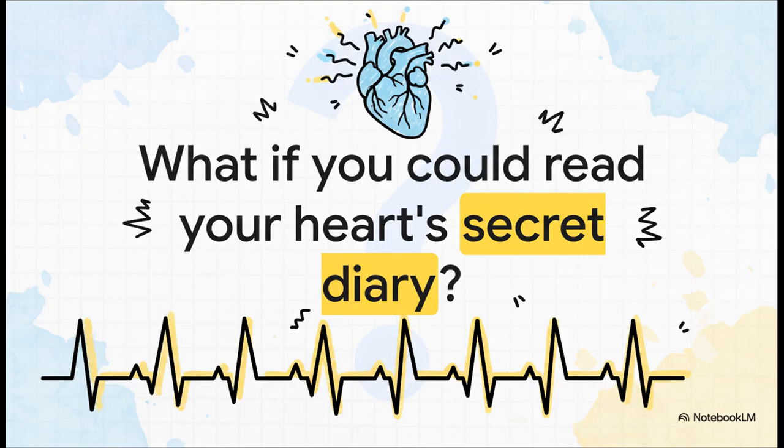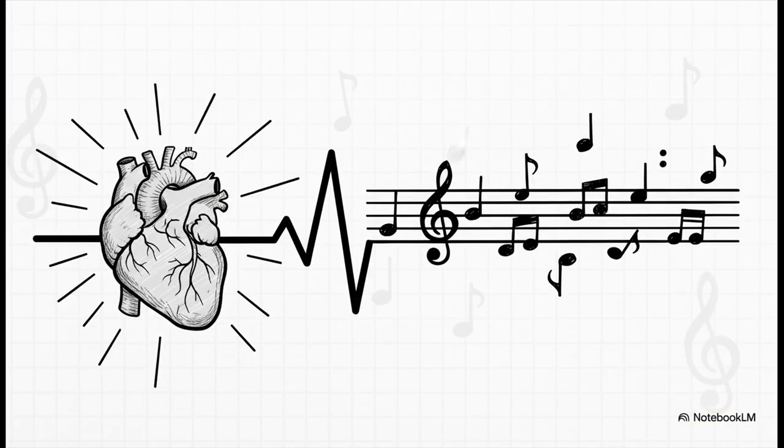And that printout is an ECG. Yeah, the ECG, or electrocardiogram, it's basically a non-invasive way to eavesdrop on the heart's incredible electrical performance, its own little symphony. And today, we're going to learn how to read the sheet music.